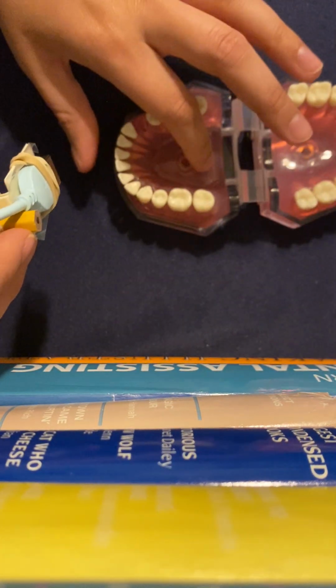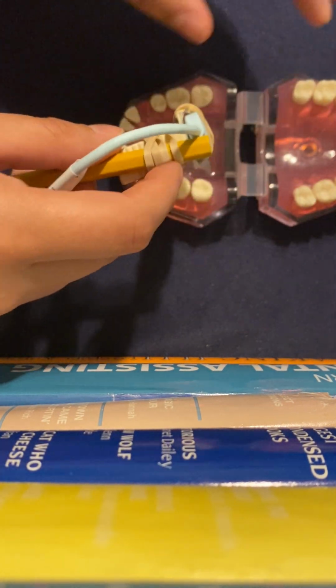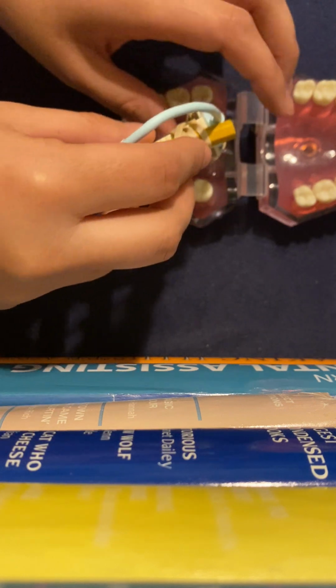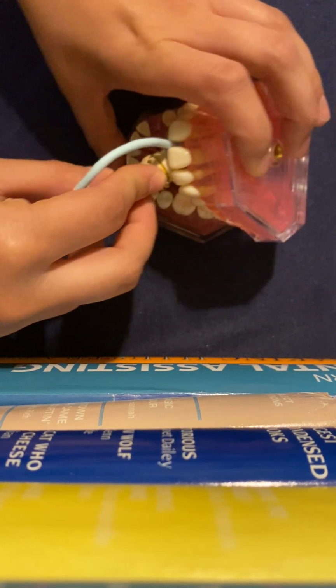And like I said, there's going to be a tongue in here, so you're going to try and push that tongue back a little bit. If they have tori, you might put a little bit on there, but your best bet is going to be to try and push that tongue back if you can. So you're going to have him bite down.